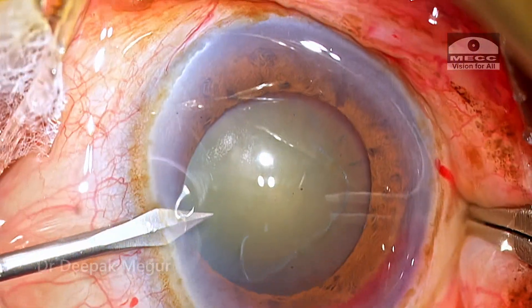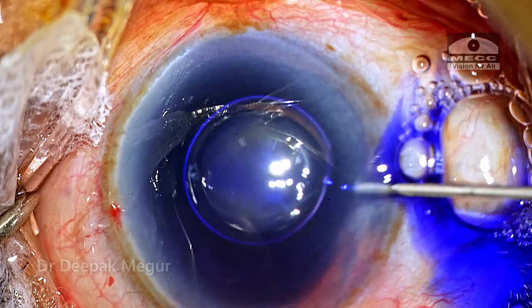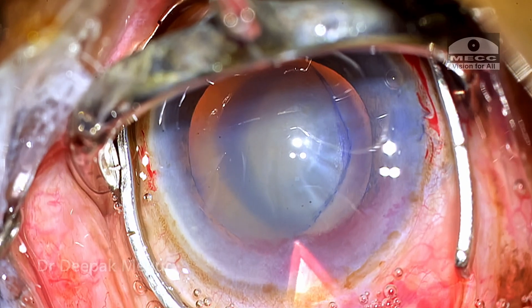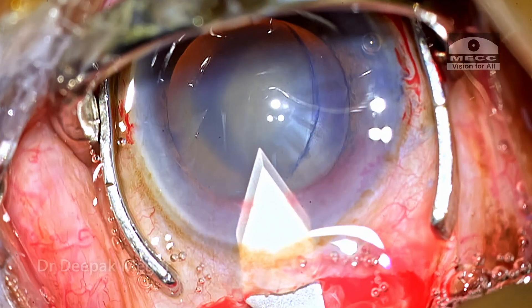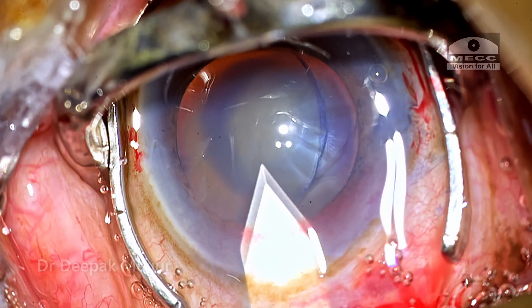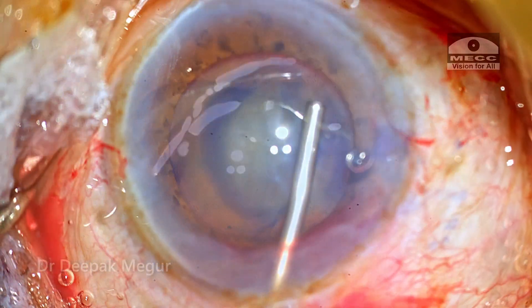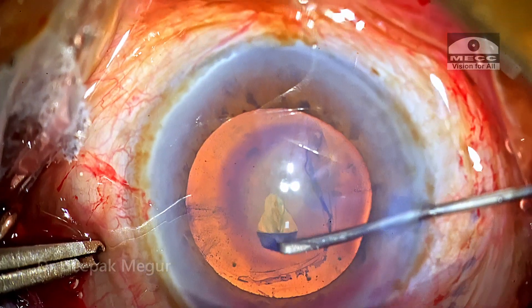The side ports are made and the anterior capsule is stained, followed by OVD injection. The main incision is created. I am currently creating a 2.8 mm incision itself and stopping at that, as I am going to perform the pre-chopping of the nucleus through this small incision itself. The rhexis is now created.